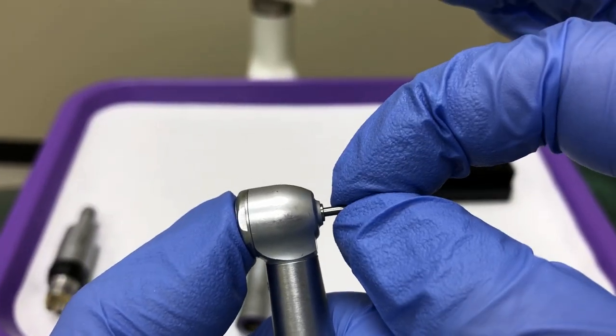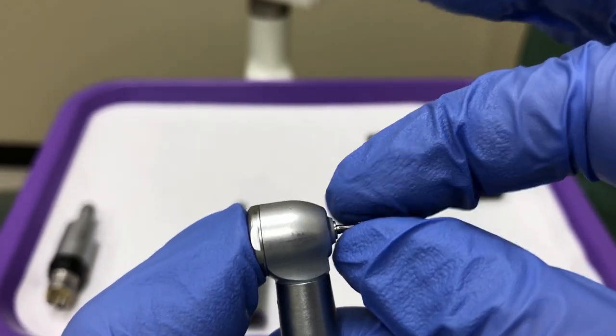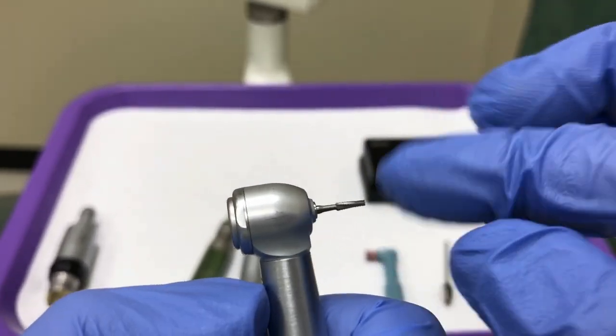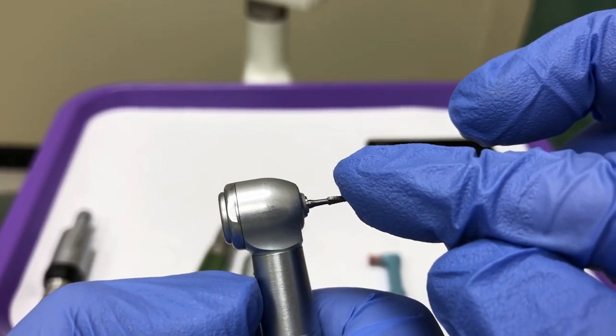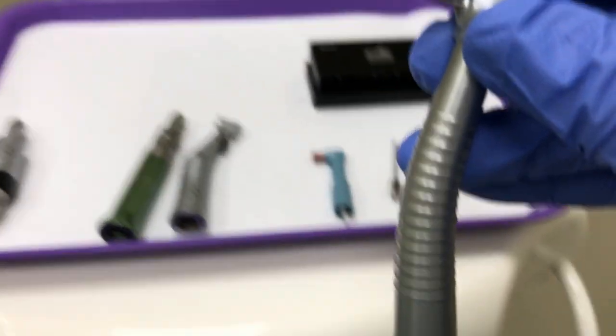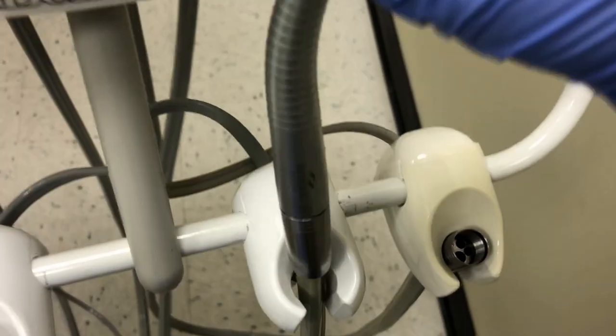Firmly push the burr into the handpiece while you're pushing on the back locking mechanism. Never push on the tip of the burr with your finger. The burrs are sharp and can easily puncture your glove and finger. Once it is assembled, you can hang it up on the appropriate holster.